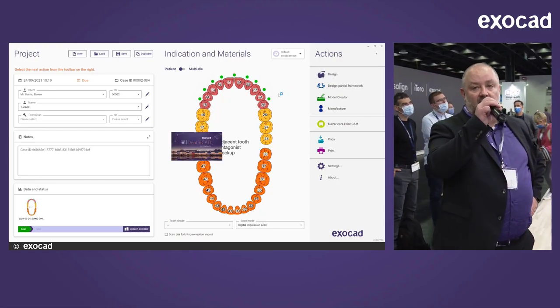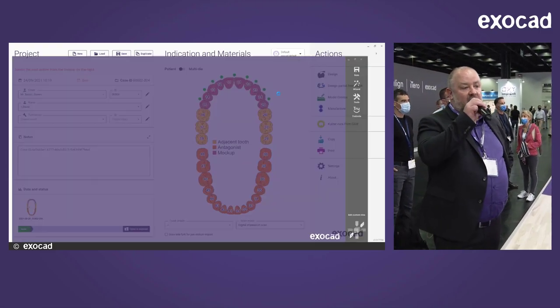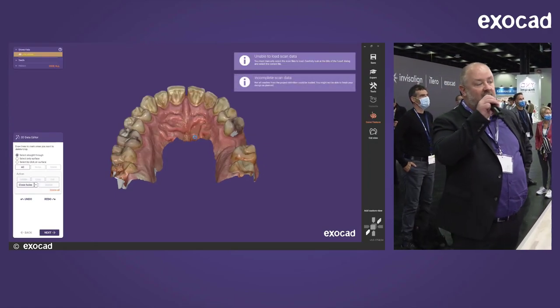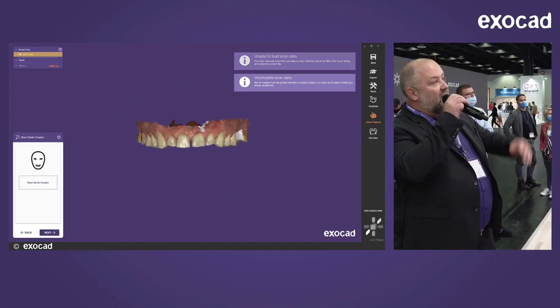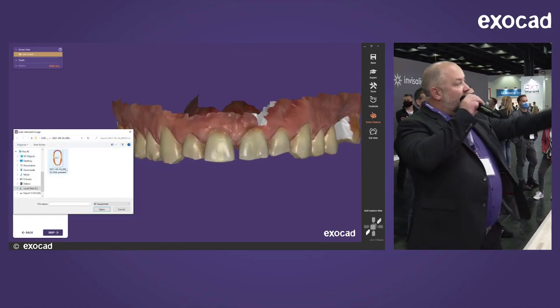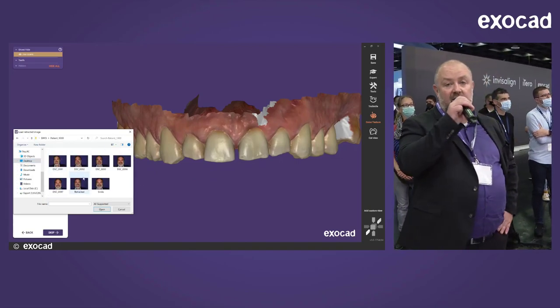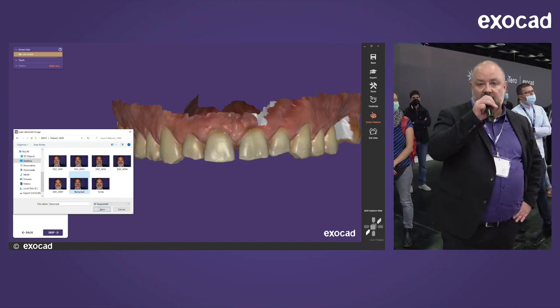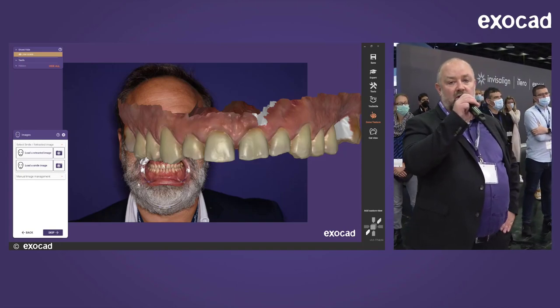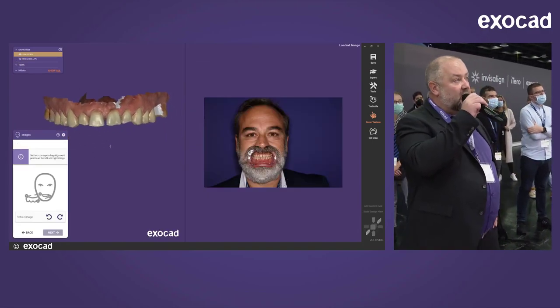Our software consists of two applications. The first is DentalDB — that's for managing clients, hardware devices, materials, and parameters. Then we start the CAD software, where the scan data is automatically imported. At the bottom left is our wizard — it's a wizard-guided workflow that takes you through the entire process. You can also skip the wizard and go to expert mode for manual control or additional functions.